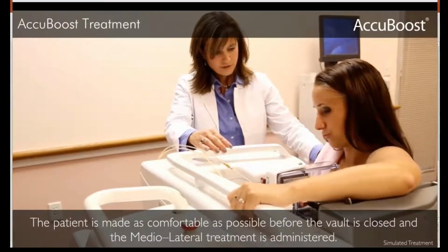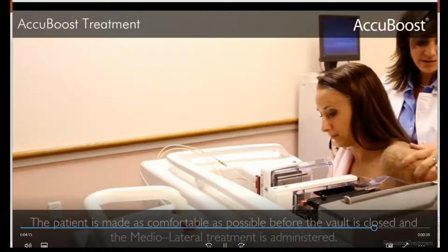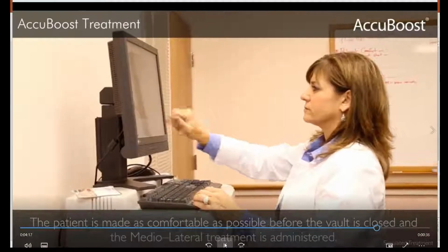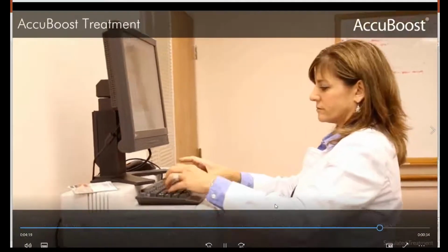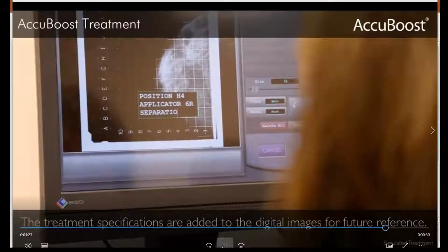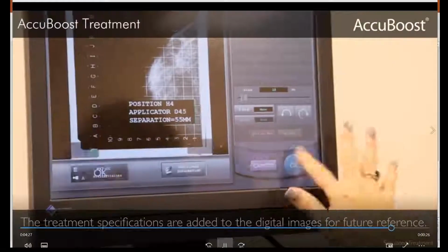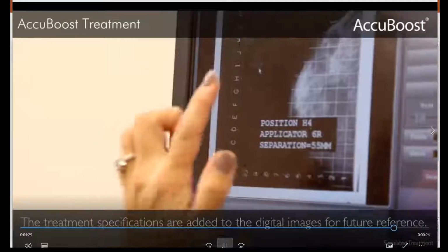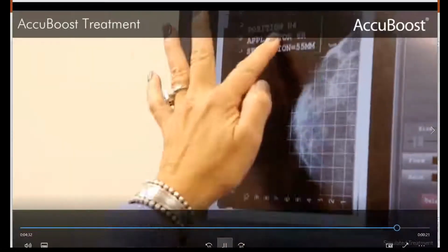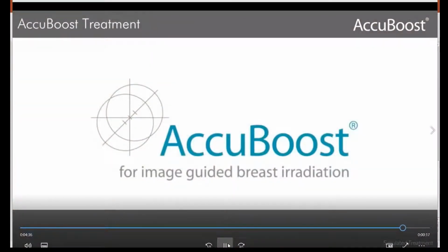So it's a relatively efficient process. And then the treatment coordinates, et cetera, all the relevant information is entered into the image file, and that is recorded into the record and verify system.